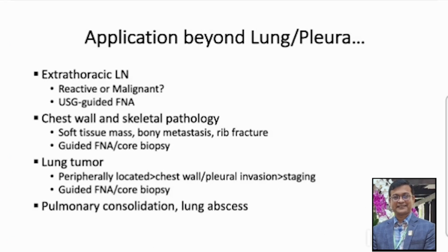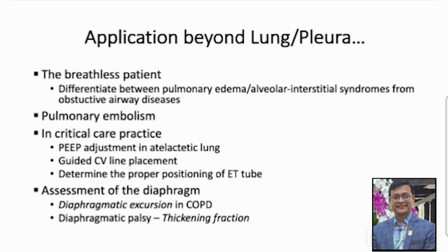We can also diagnose pulmonary consolidation and lung abscess. For the breathless patient, we can differentiate pulmonary edema and alveolo-interstitial syndrome from obstructive airway diseases. In critical care practice, we can adjust the PEEP in atelectatic lung. It can guide CV line placement and determine the proper positioning of the endotracheal tube by doing a thoracic ultrasonography.